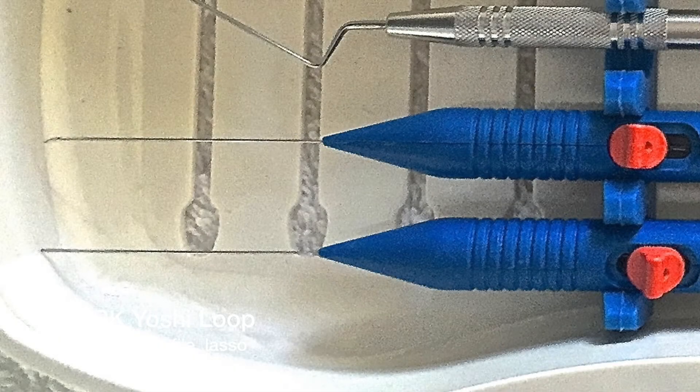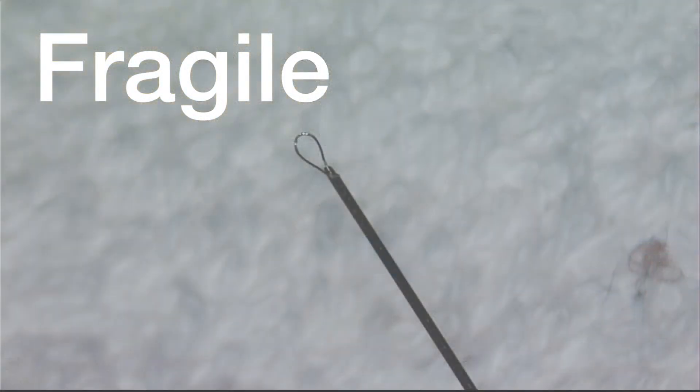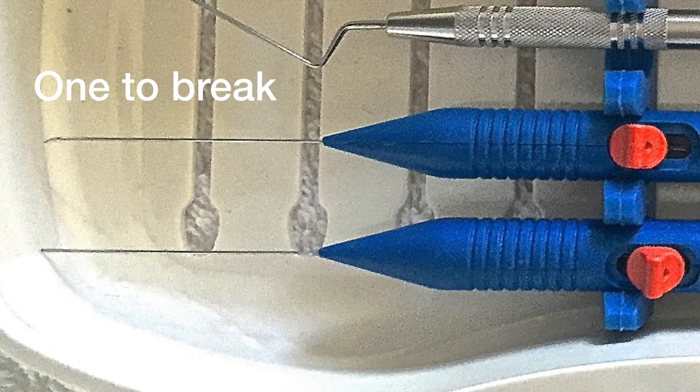After a lot of experience with new users as well as my own experience, we understand that these loops are very fragile. They're very tiny to get them down a canal, around a file, and then be able to pull the file back out. You may notice that we have included two of them — you will invariably break the first one. We wanted a second one there for you after you figure out what the appropriate forces should be.